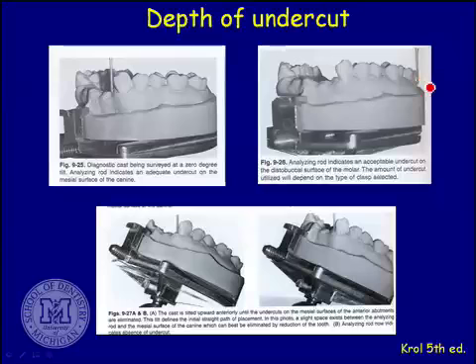So can you see if we took a high-speed diamond and just rounded the occlusal buccal corner of this tooth a little bit? So we still had undercut down here at the cervical, but our undercut was softer. There was a more gentle curve going into it. People follow that okay? Because again, if your height of contour is absolutely at that occlusal buccal corner, there's no gentle curve for the clasp to flex over and seat.